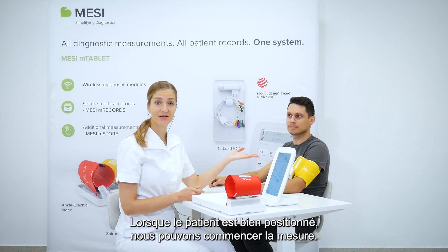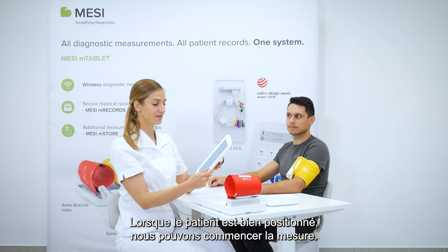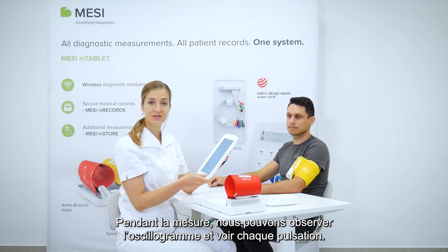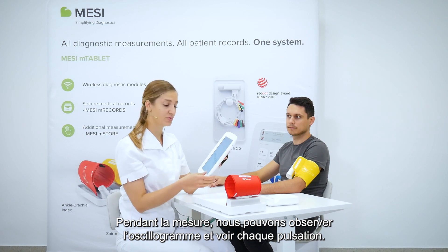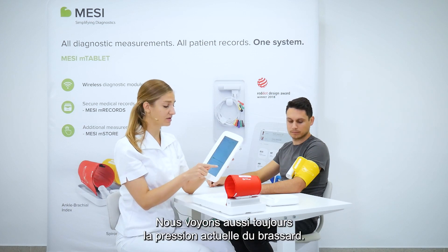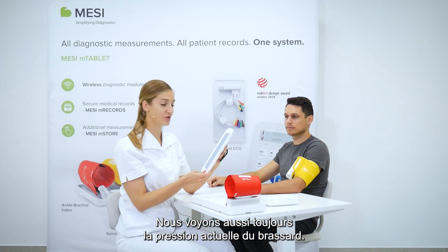Now that the cuff has been positioned correctly, we can just start the measurement. During the measurement, we can observe the oscillation graph so we can see each individual pulse. We are also always able to see the current cuff pressure.